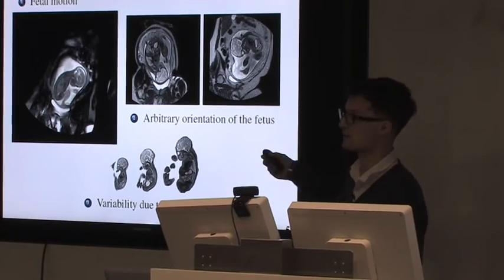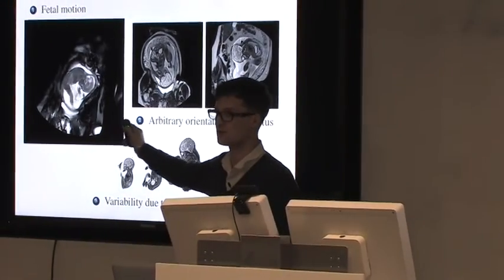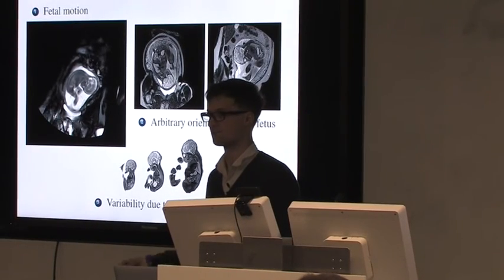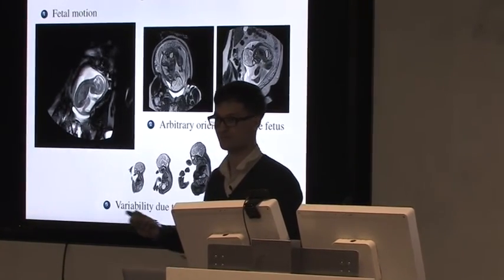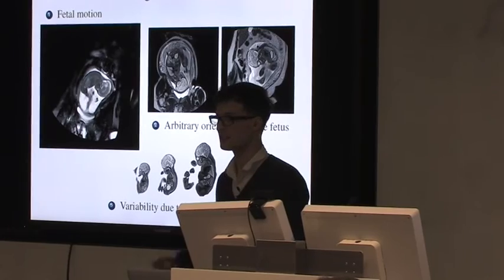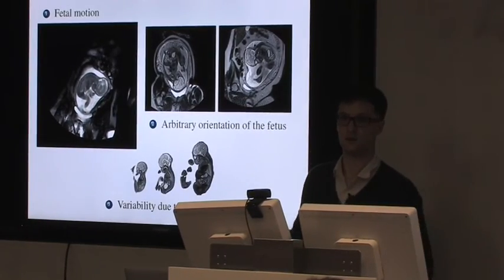And so that's some examples of fetal MRI. As you can see, the fetus moves during pregnancy, and imaging data takes time, so you have to deal with this. And my task is to automatically find the fetus.